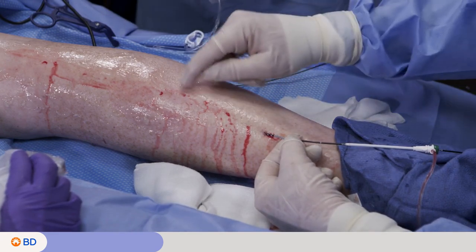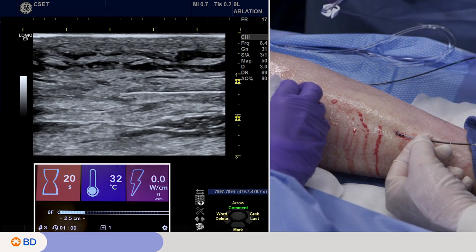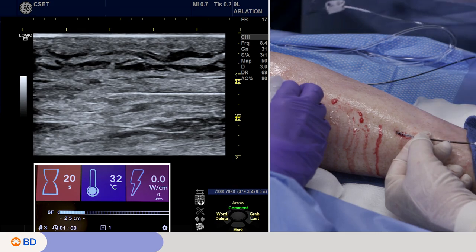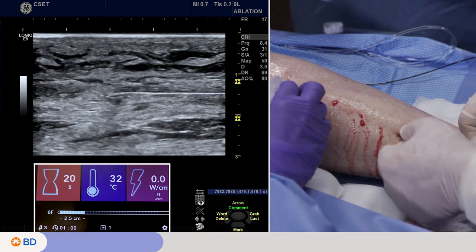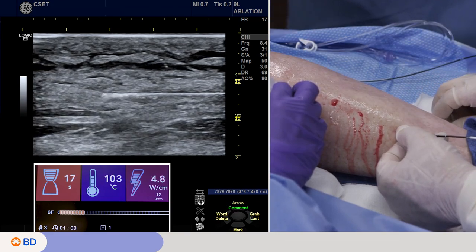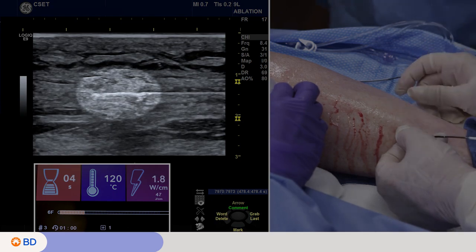We're going to do one more treatment just above where we saw the sural nerve, which we can verify with ultrasound. Carina switches the catheter with a simple push of a button on the screen — you can see it went from a 10-centimeter coil treatment length to two-and-a-half centimeters, with an audible feedback tone change to confirm. I hold my hand near the coil outside the skin as a safety precaution — if there's a malfunction or we didn't switch, it will burn my hand. We activate it and it still delivers the 20-second treatment. On ultrasound, we can see the two-and-a-half centimeter treatment length right at the distal tip.